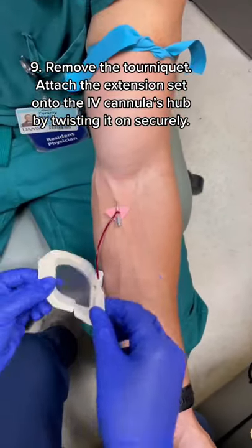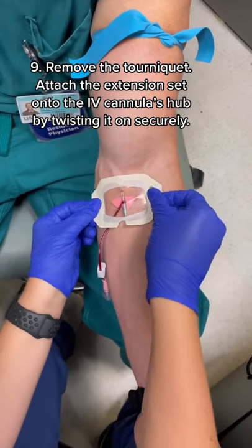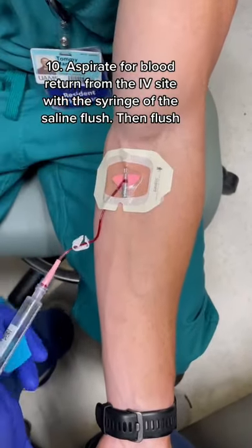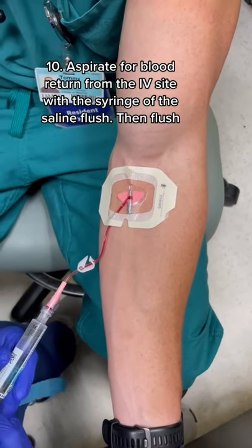Once cannulated, remove the tourniquet and attach the extension set, but some IVs come with this already attached. Lastly, make sure that you can easily aspirate for blood and flush the syringe.